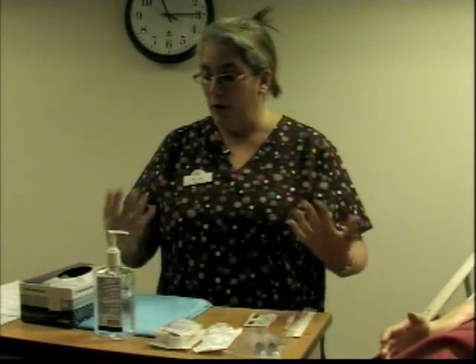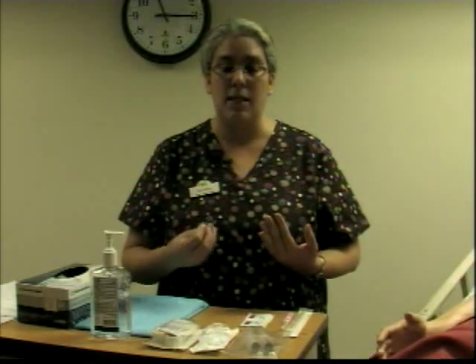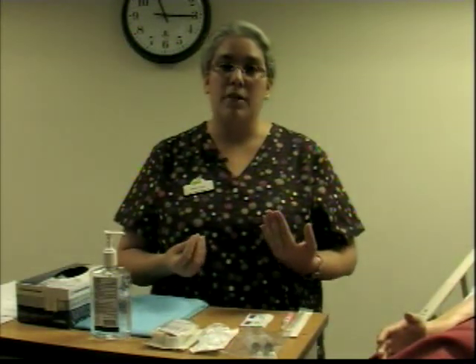So as you gather all that information, the next thing is to gather all your supplies. What size of IV catheter you're going to use depends upon what the therapy is going to be for. If you're starting an IV to transfuse blood, you want a large bore because blood is a lot thicker than fluids, and you want a site that can tolerate that type of volume and thickness. So the preferred size for blood is 18 or 20.